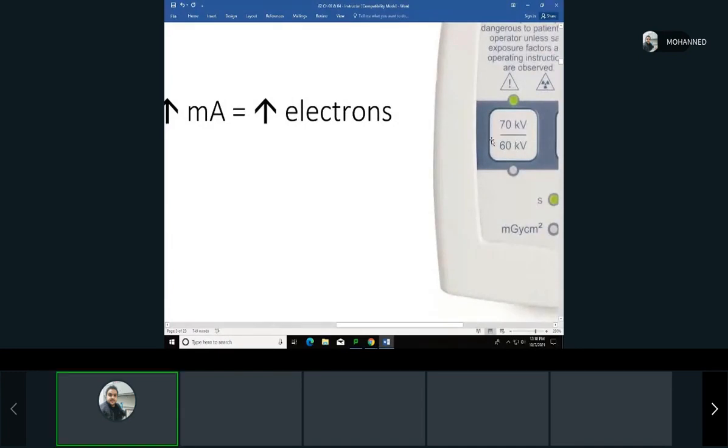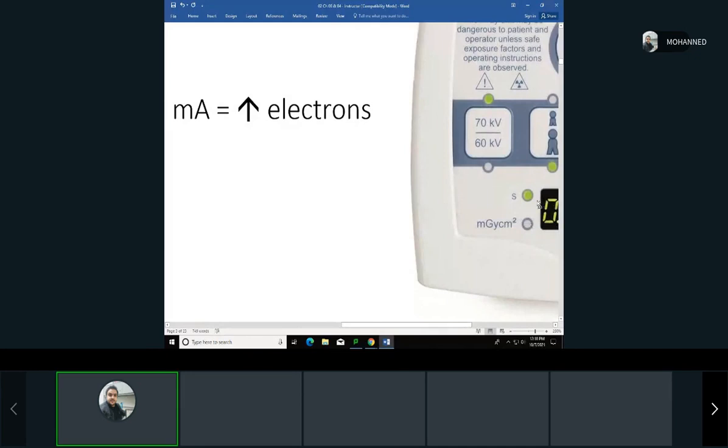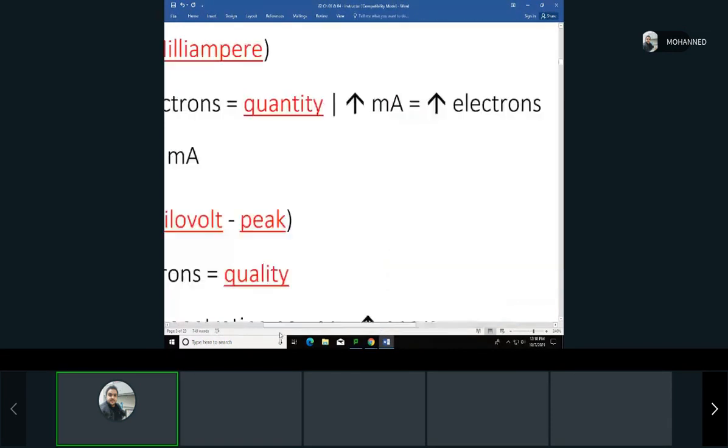So it can range, but the peak, the most that it can get to, is 70 kilovolts, okay? The milliamperage is fixed. It's just that specific number that they put. So we don't have a milliamperage peak. We just have a milliamperage, okay? And with kilovoltage, we have kilovoltage and kilovoltage peak. Does that make sense? We're good so far?